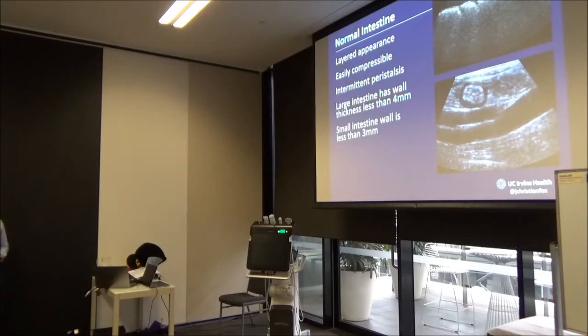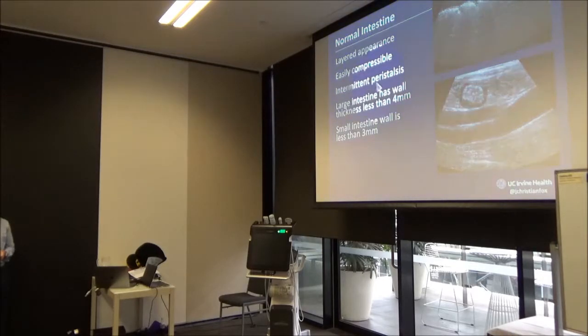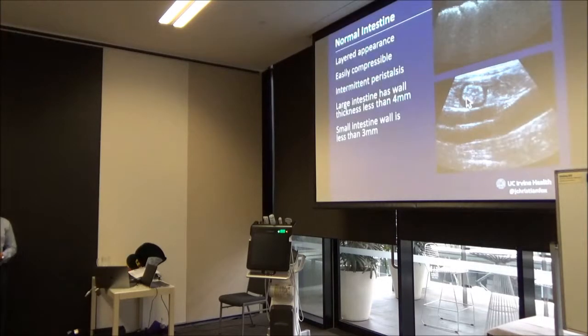You can actually see sometimes in the short axis over here, when the bowel is mid-peristalsis and there's no air in its lumen, you can make out the outer wall being very hypoechoic and that inner submucosal area being very hyperechoic, and that's normal. That's what we expect to see once the air is out of the way and you can see it.